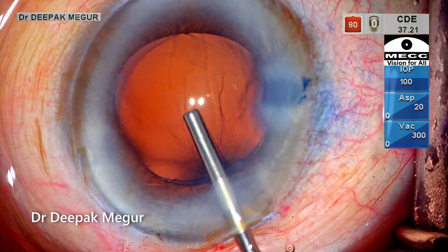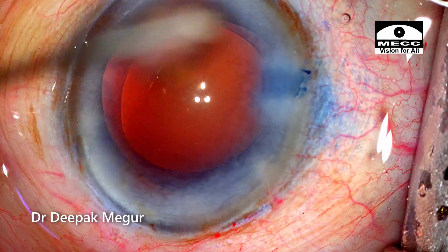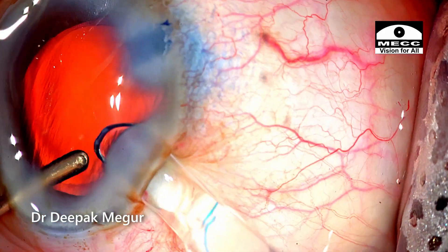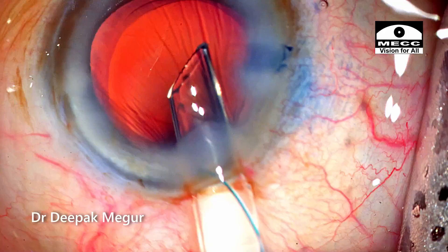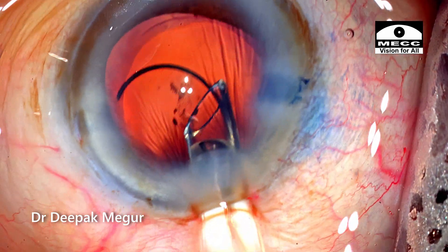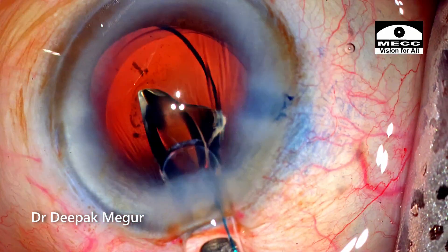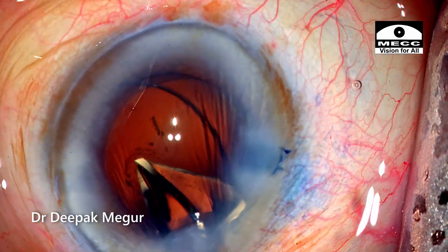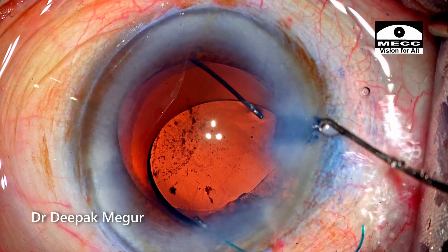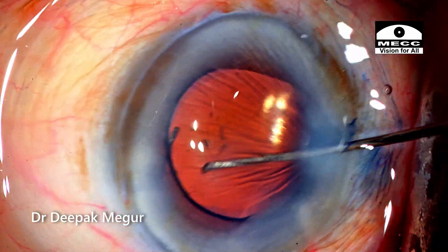OVD is used to form the bag and a multi-piece lens is placed into the bag. First, the distal haptic is gently negotiated into the bag. Then the proximal haptic is gently dialed into the capsular bag.